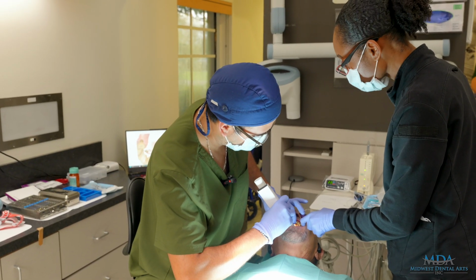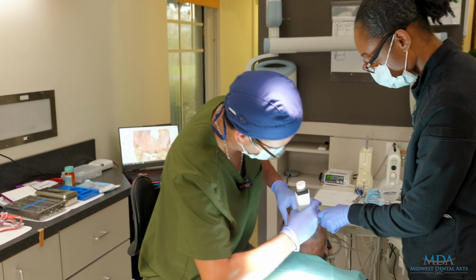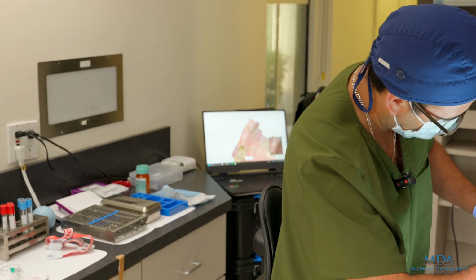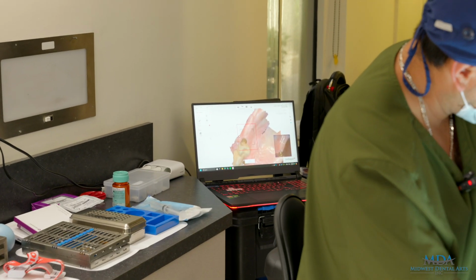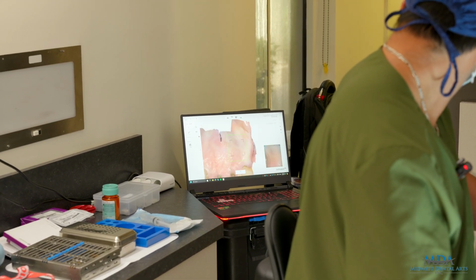And the most important now, of course, is the palate. So the palate, it's very important because we use it to align and to get all of very important information so that we can design good teeth, you know.